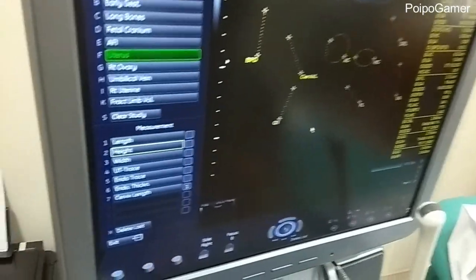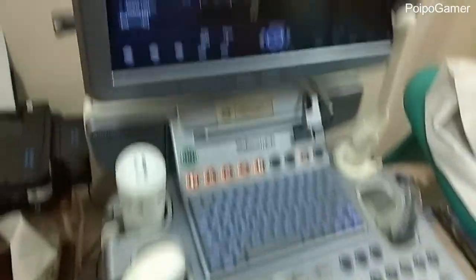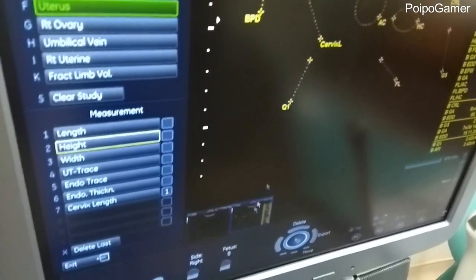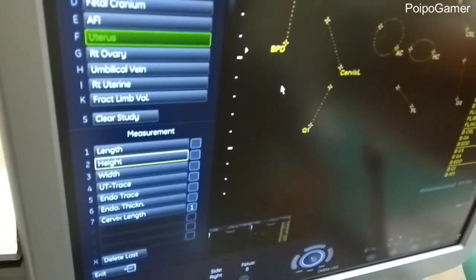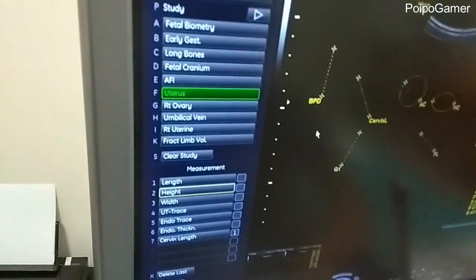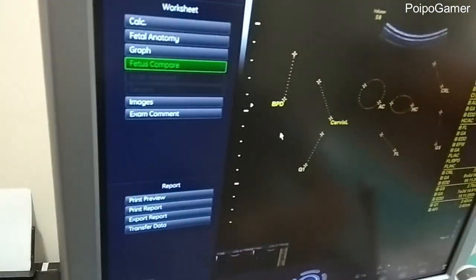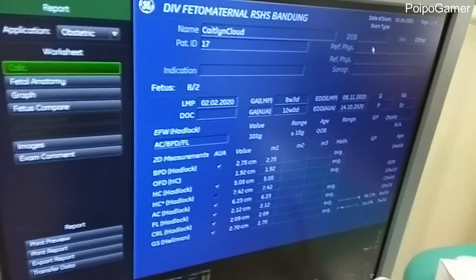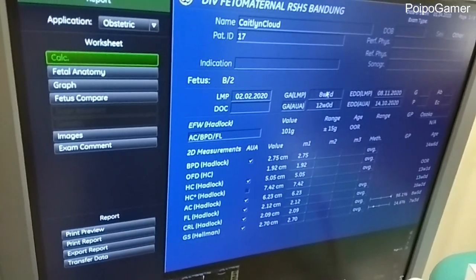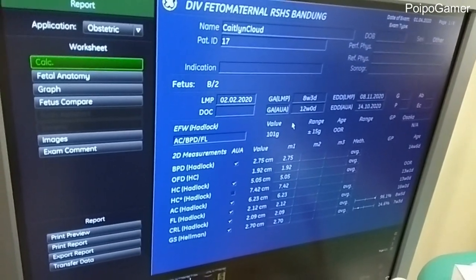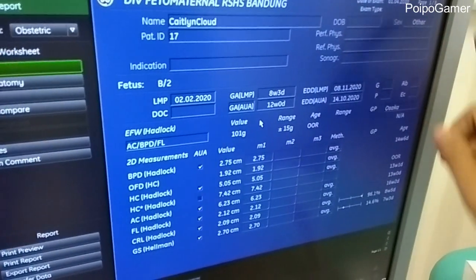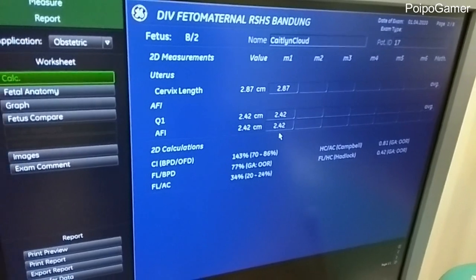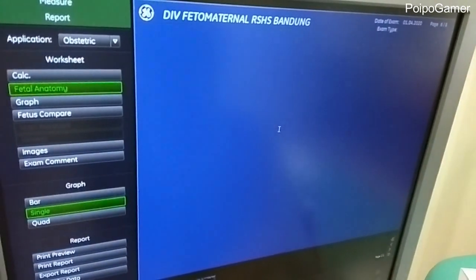So after this, it's finished. Take a picture — we can take a picture, and this is it. And after that, we can send this data using DICOM. So we need to go to report first, then archive. So this is the items that we just input previously, and we can switch pages — this is the first page, and then if you click this, you will be switched to the second page, third page, and so on.